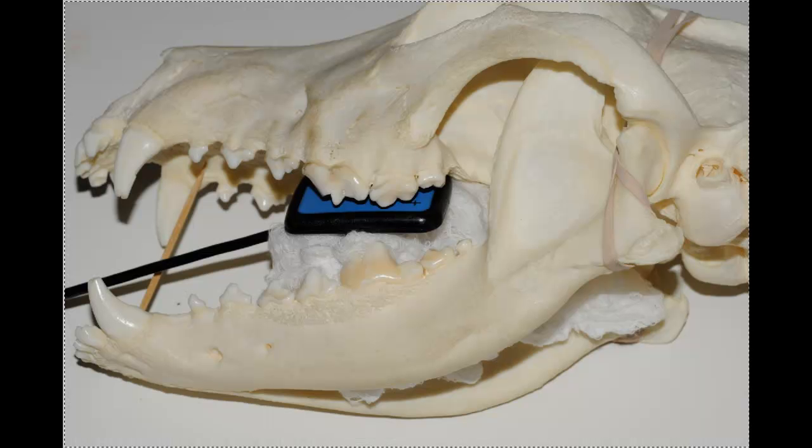Moving to the upper arcade, we are going to go for the upper fourth carnassial and molar 1, and if we're lucky we might even get molar 2 all in the same shot. This is very large. We want to maximize the use of the sensor by putting this edge as close to the crowns of the teeth as possible, and the other edge will be up against the palate.